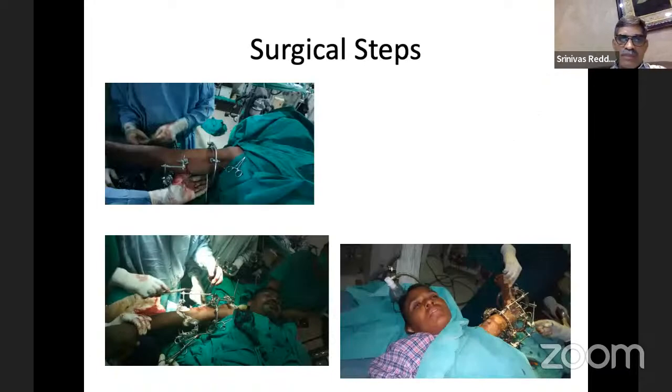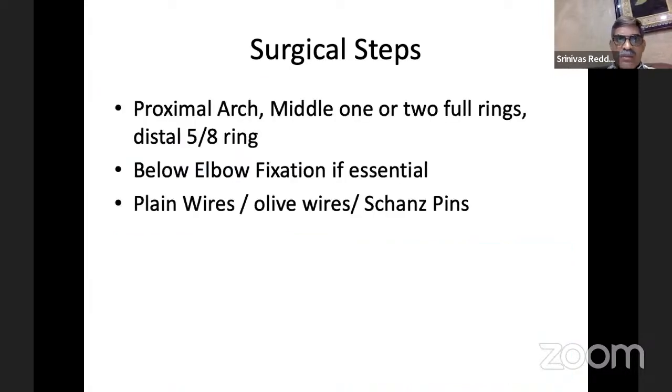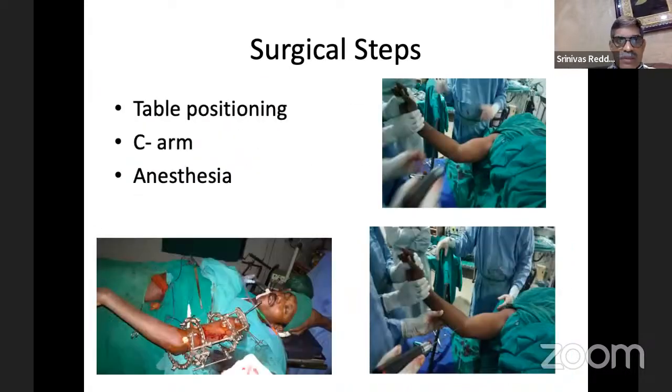And the surgical steps. It is under general anesthesia or local, meaning regional anesthesia. The table positioning is to be taken care of. We have to reverse the table. In general, the head end should be reversed so that the C-arm will be proper. We can visualize the C-arm properly, and the C-arm to be kept in proper position.